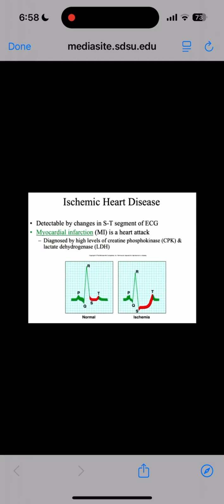Now, I would never ask you guys to do that. I mean, I've had a course in electrocardiography. I'm in no way an expert. It takes years. But conceptually, you should be able to understand how a cardiologist could look at all 12 leads and realize something's wrong because the 12 leads don't add up to what, quote, normal. Okay. Any questions about that?